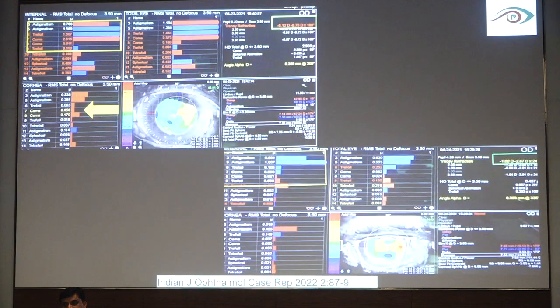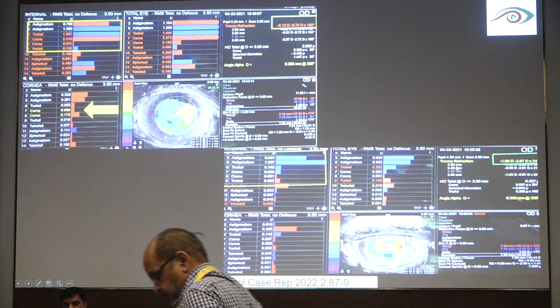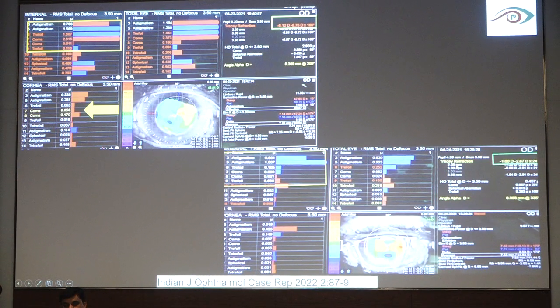This is a small example where a patient was implanted with an iris claw. In the first diagram, we can see the aberrations which are causing this, your astigmatism, and this is your residual refractive power which is left. But when you take the same patient up and re-claw and make the lens stable, the whole thing is changed. Your astigmatism is changed, your refraction is changed, the amount of aberrations is changed. So basically the patient starts becoming happy.